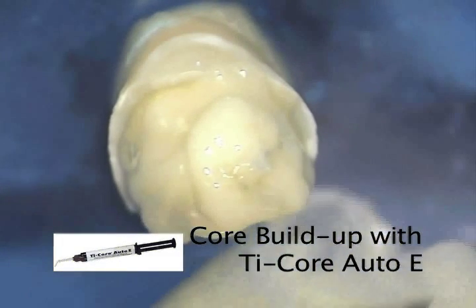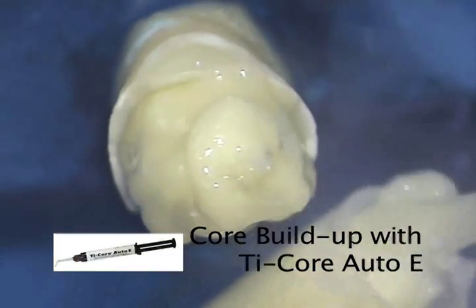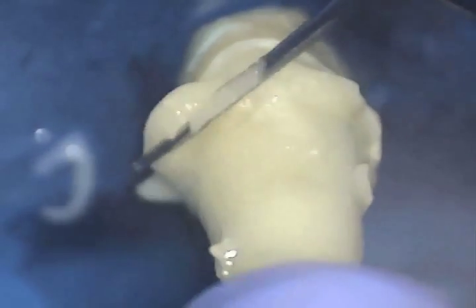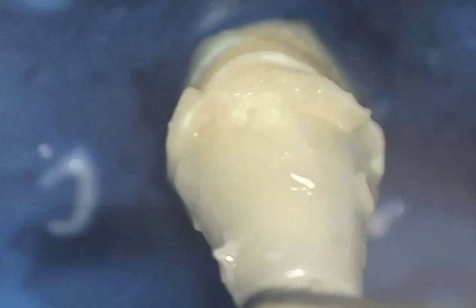Once the post is covered by the Tycor, we then fill up the appropriate size clear core form with more Tycor. The core form is placed over the post and the excess material is removed. We cure for approximately 40 seconds per 4 mm increment of material, adding a little extra time since some of the light is absorbed by the clear core form. The core form is then removed and the core can be prepared to its final shape.